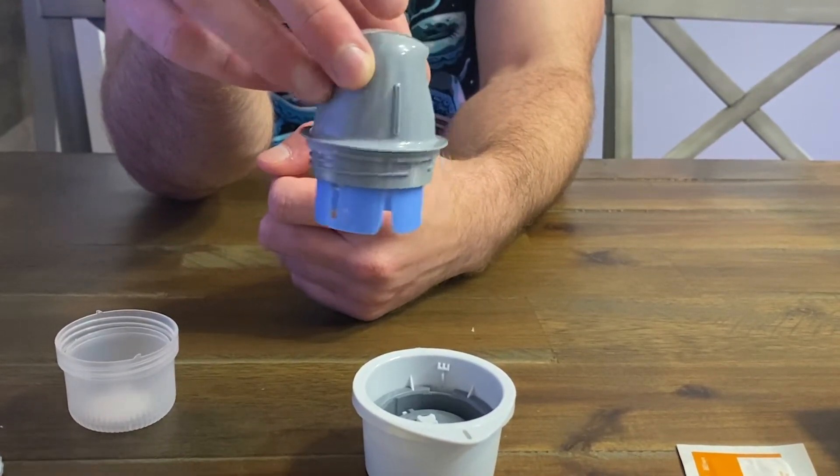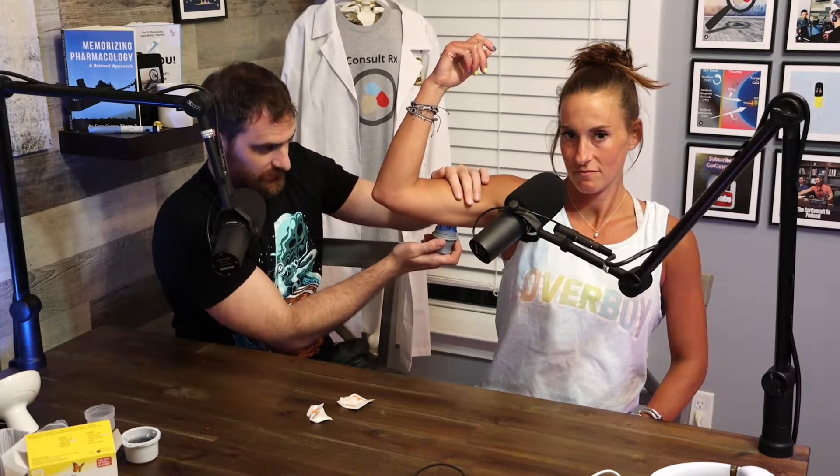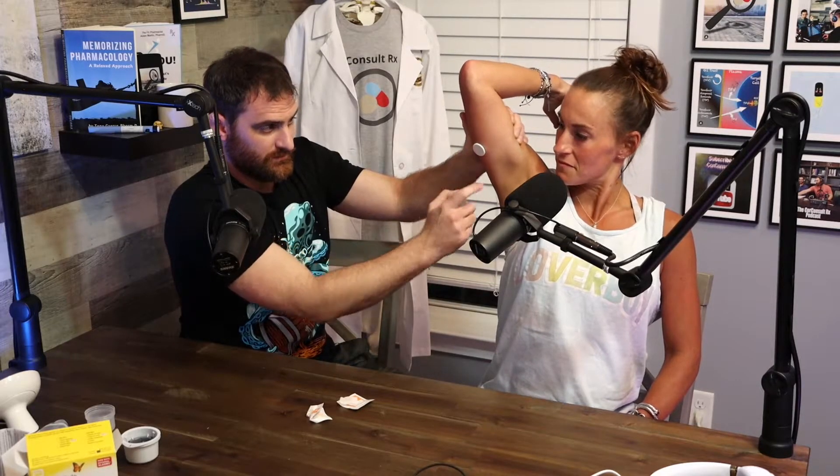Let's put it on her. We're going to alcohol swab her arm off. Once it's clean, you have the patient relax the arm — you don't have rigor mortis. Then have the person make a muscle basically, and then take the applicator and put it up on the bottom of the arm this way, then just push up and you'll hear an actual click. Then you can see it there — just kind of lightly push around the area, and that's it.